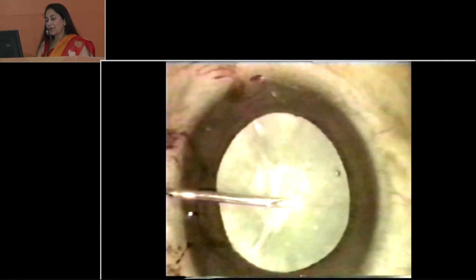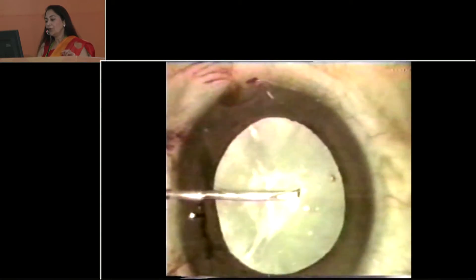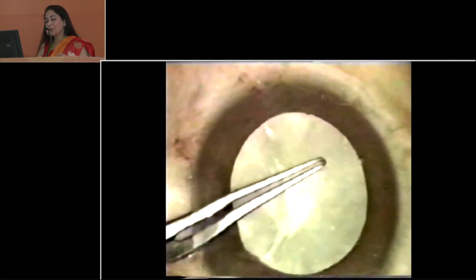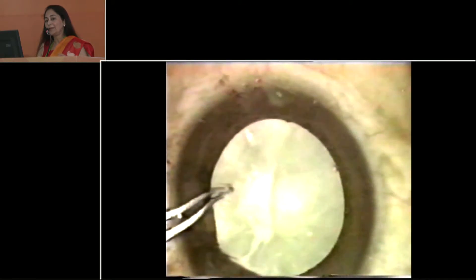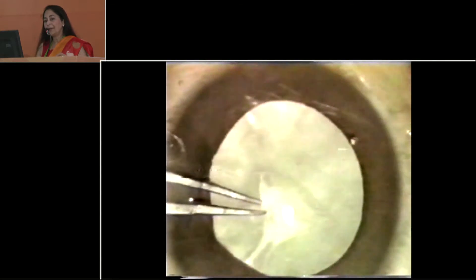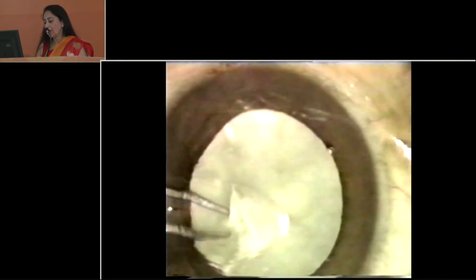This is a fibrotic plaque. Whenever you have to raise a little edge, you don't go in the center — this is the only situation where you don't. Instead, you see where the fibrotic plaque is ending and start doing your rhexis from that edge once you have lifted the flap, then try and go around the plaque.